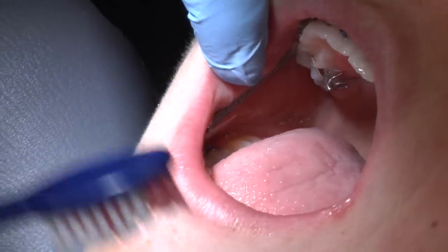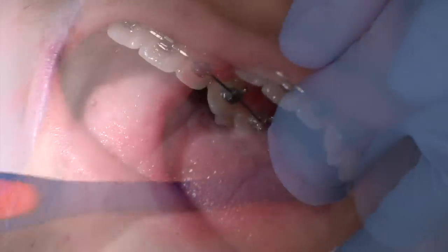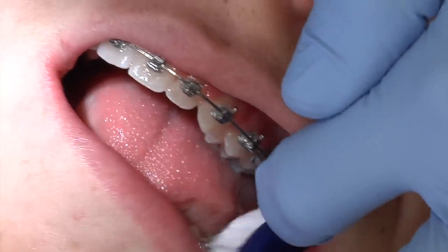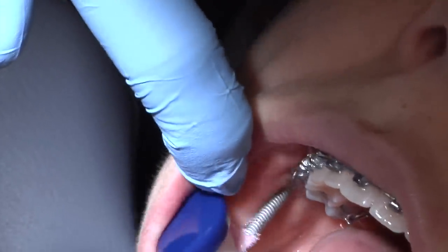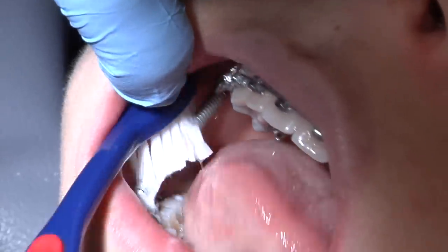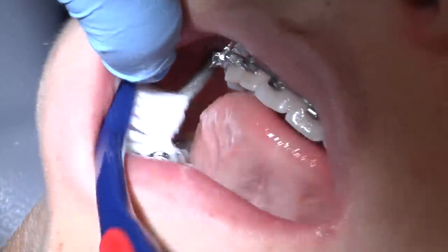To keep the Forces springs clean, use your toothbrush — both electric and manual — and clean all around. You want to clean the rods, the elastics, and get in everywhere where the springs are. Just like plaque will grow around the teeth and the gums, it's going to grow all around the appliances, so you really want to make sure you're thorough with cleaning everything. Don't be shy in any areas.